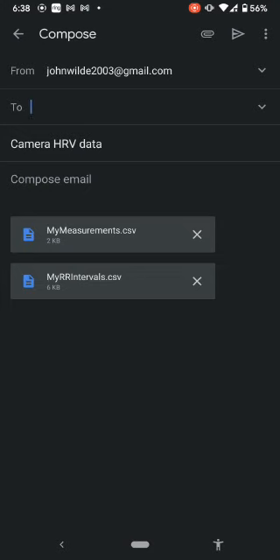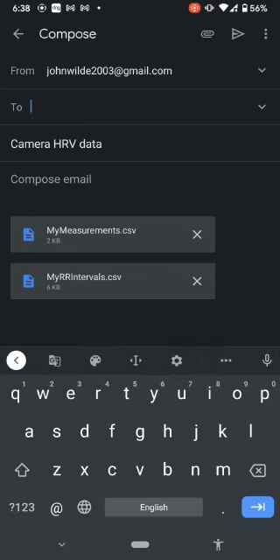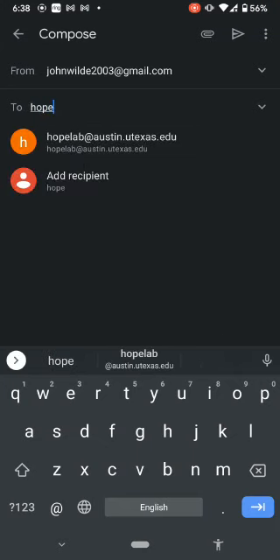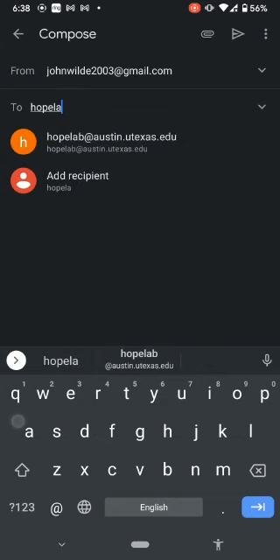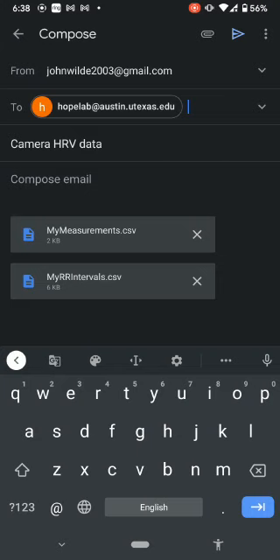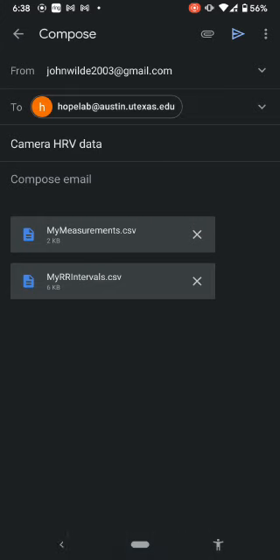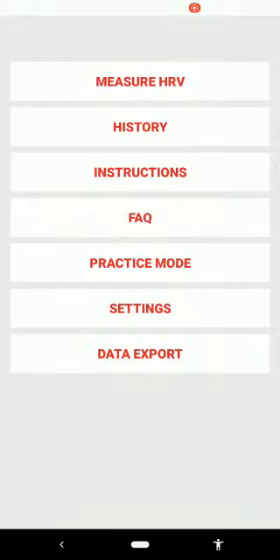With the blinking cursor in the 'To' field, click right there and type hopelab@austin.utexas.edu. Then click anywhere else on the screen — click 'Compose Email' in the middle, which will light up a blue arrow at the top right. Click that blue arrow to send, and the data is sent over.